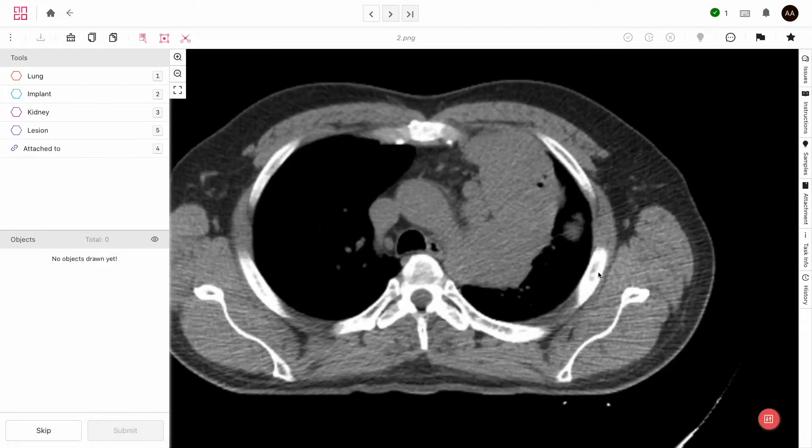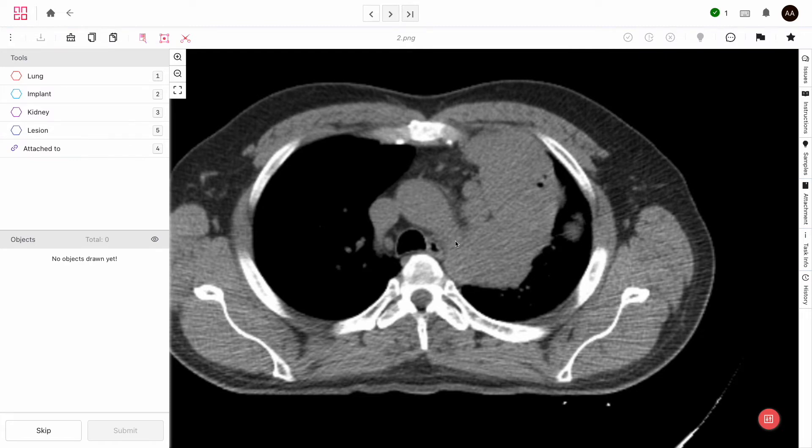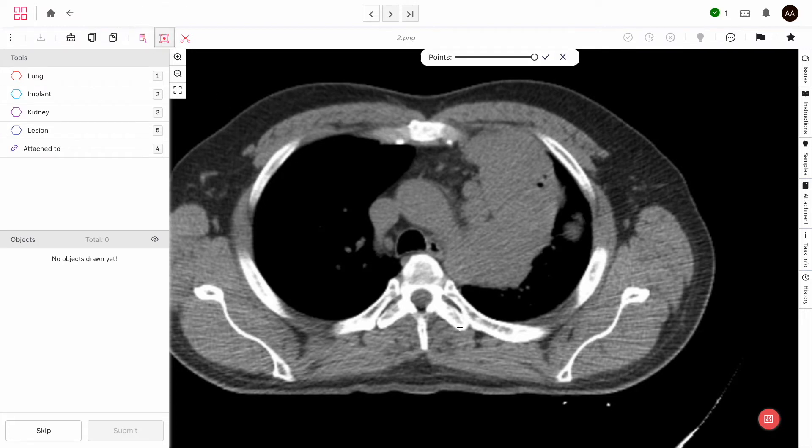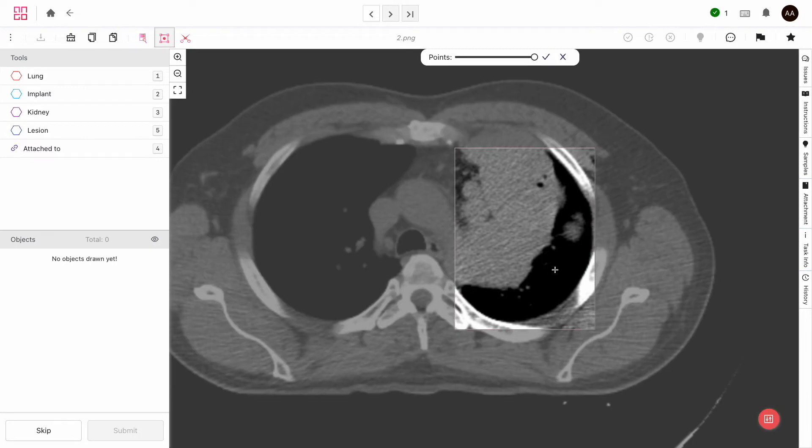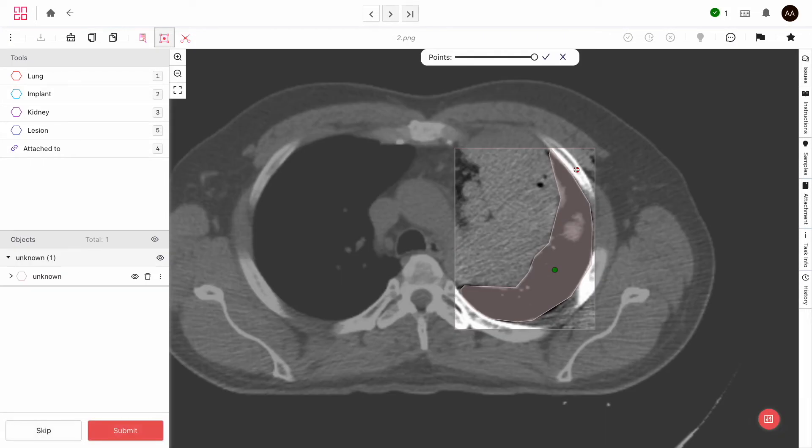So here's a CT scan section. This black entity here is a lung. So let me show you how we can label that using our AI assistance tool frame cut. Select frame cut from the toolbar here at the top and draw a box around lung. Left click on the parts you'd like to include and right click on the parts to exclude. Usually two points are enough. When you're done, press Z and Englehub will do the rest.